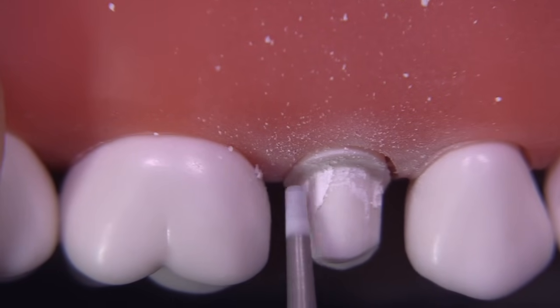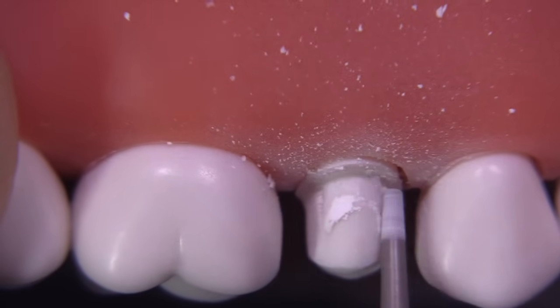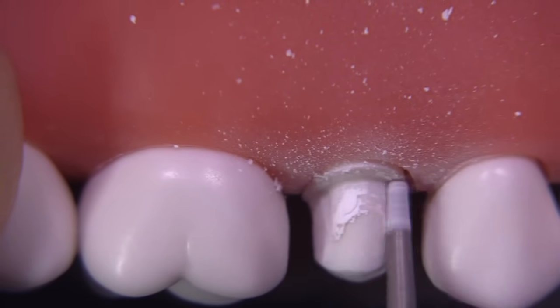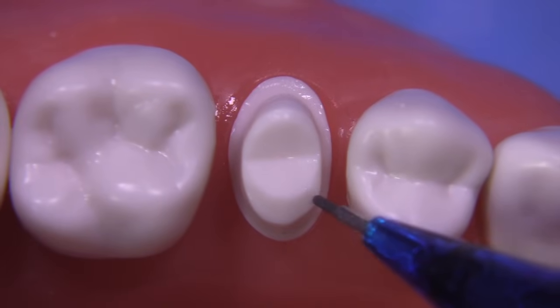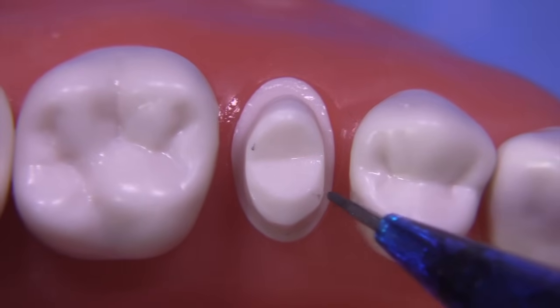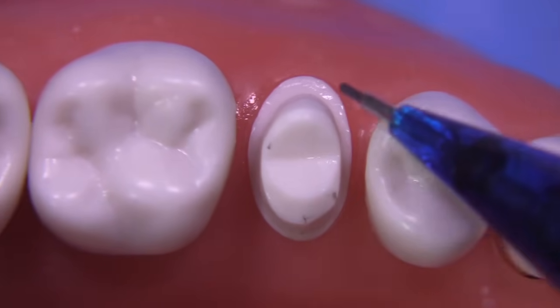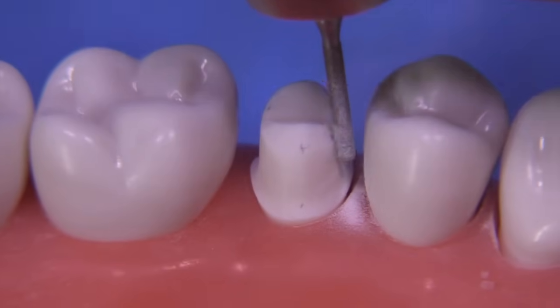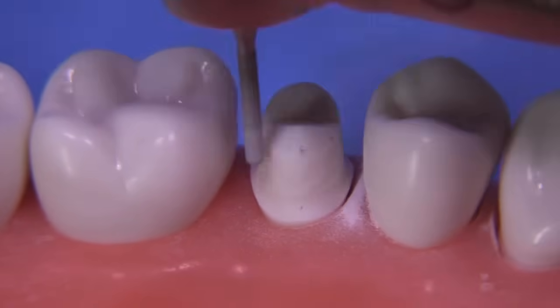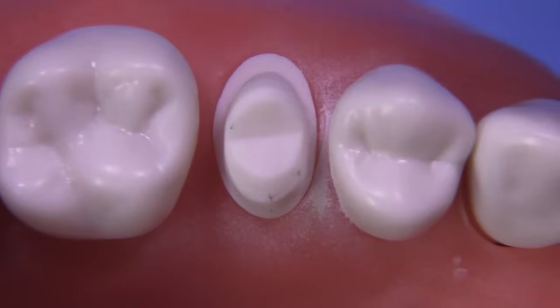The shoulder should really extend from one line angle on the mesial to the other line angle on the distal, or a little bit further beyond that — when you do that, you leave these little wings. The wings are okay to leave, but I typically remove them as I like a smooth flowing outline of the final preparation. When you're getting near the end, this is the time to be really critical — look at any area that might be undercut or under-reduced, note those, then modify them. I would never use a coarse bur at this point; stay with the fine diamonds for this remaining portion.